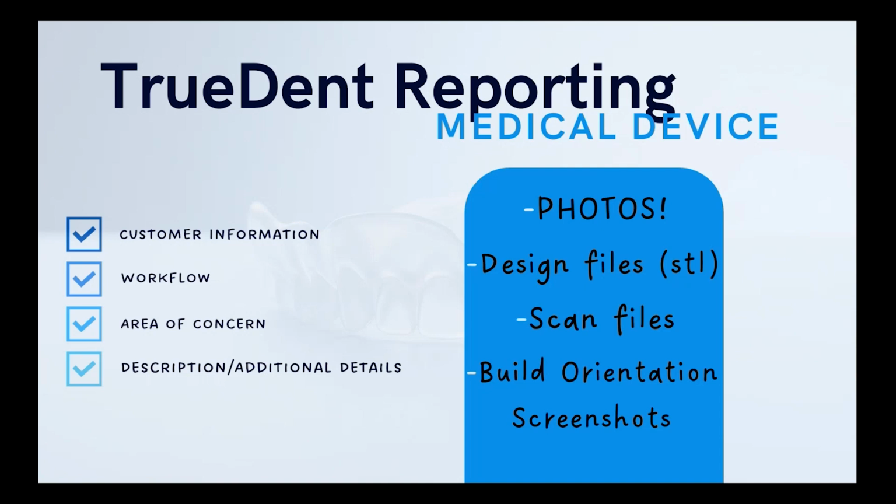Print times. So if you were having an incident during a print, letting us know what time that print took place and what time the incident took place is very beneficial as well. Chances are we'll be getting logs from you if it's a significant software issue or printer issue, and it helps us to narrow down what part of those logs we should be focusing on. The models themselves, both photos and actual STLs, are extremely helpful.